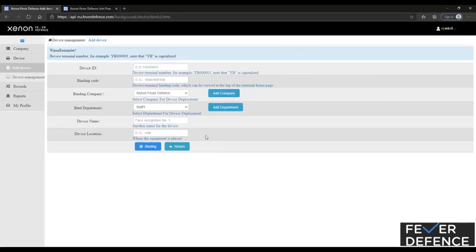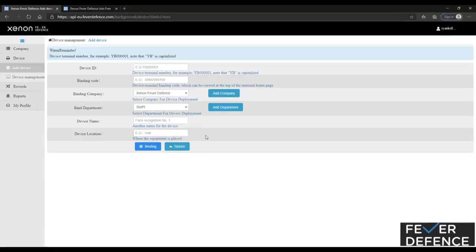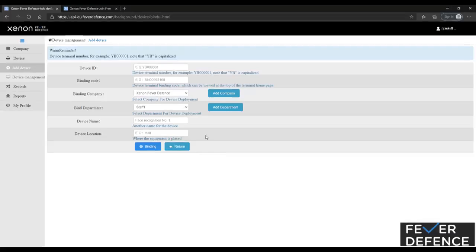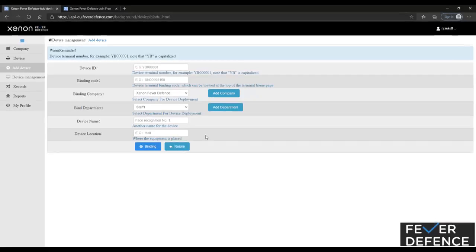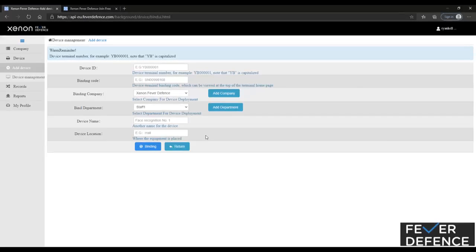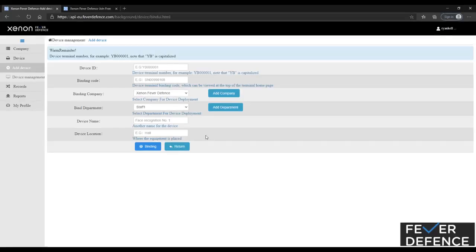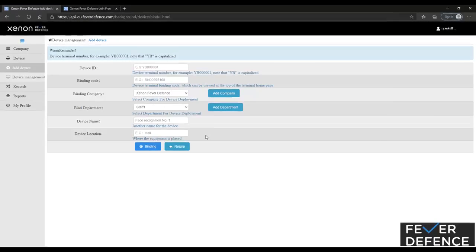Location can be handy when it comes to, if you have multiple devices, you'll be able to tell exactly where that device is if a high temperature does present to the unit. And again, that'll show up in the records, I'll show you that a little bit later on.